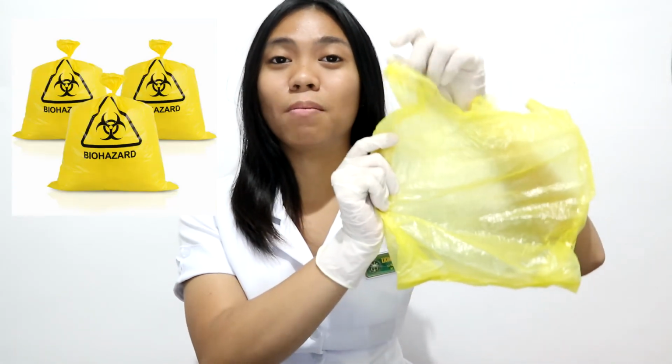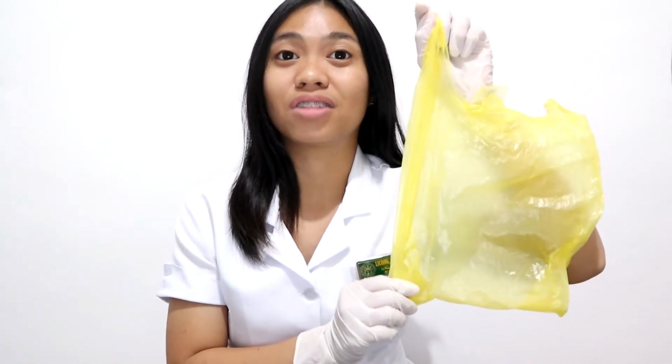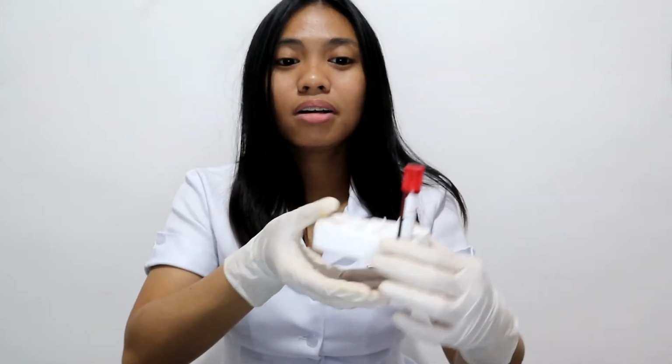As a phlebotomist, you must always have what they call the yellow bag. So this yellow bag indicates biohazard waste. So it is purposely used for the disposal of clinical wastes. Doing all this procedure will yield us a tube with our blood. So don't forget to label it properly, as what is being asked in the tube, and safely place it where it won't be a hazard to anyone.